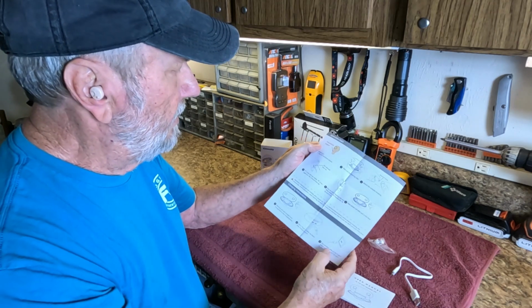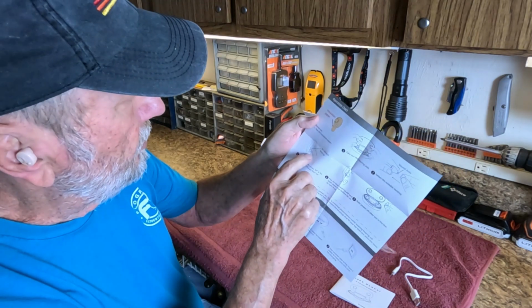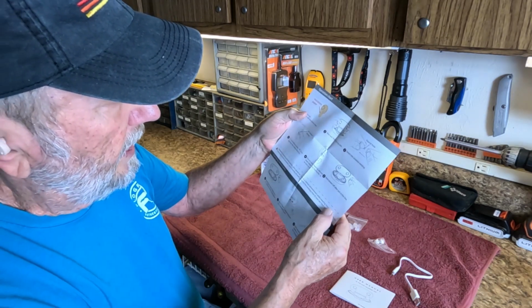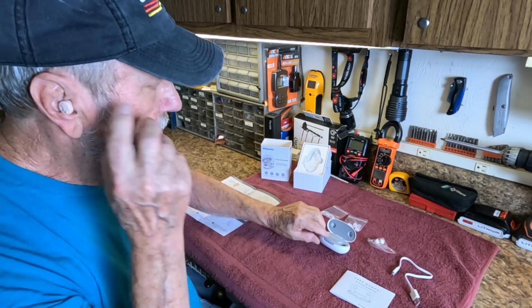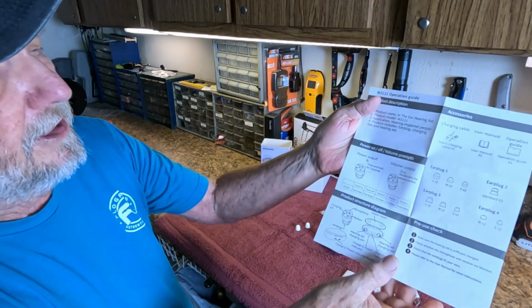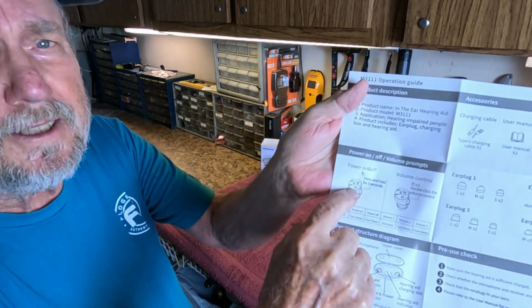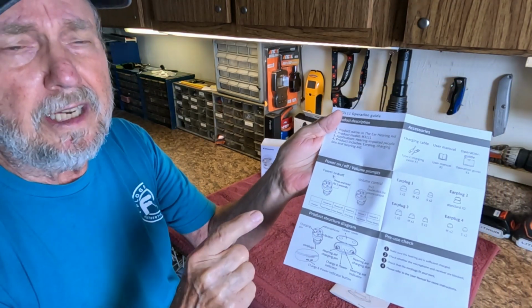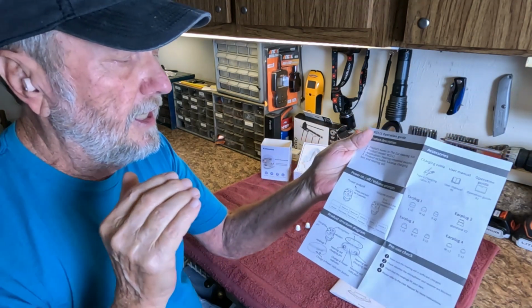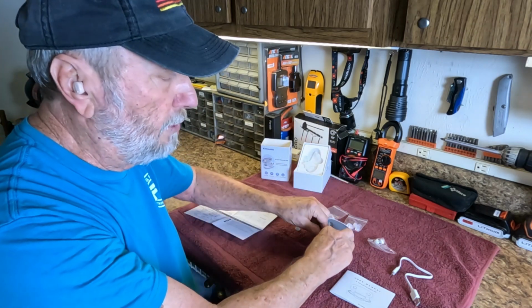And according to the instructions, they're showing you microphone should face up, and the button should be down. And that's the way they go. And one of the things, when you have these powered on, and we'll show powering them on, is on the back side. Power on, off, and volume control. And we press this button right here for 3 seconds, and it turns on. Also, you press it for 3 seconds and hold it for 3 seconds, and it will turn off. But turning off, you don't have to worry about. You can just pull them out of your ear and put them in there.